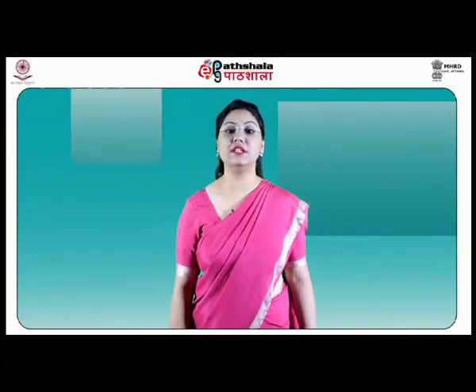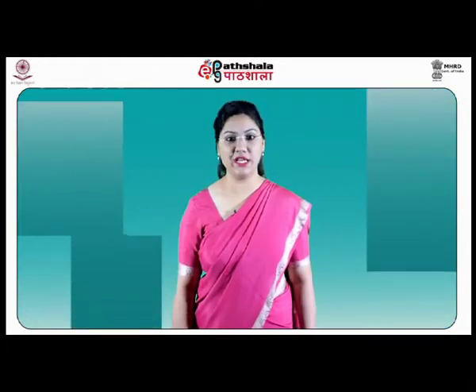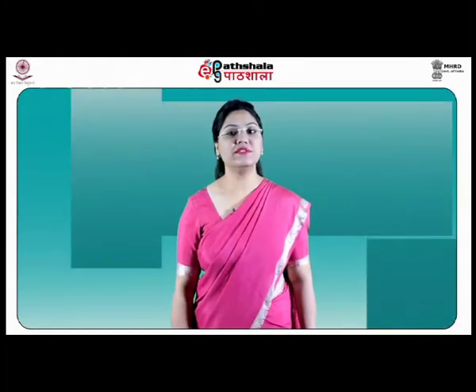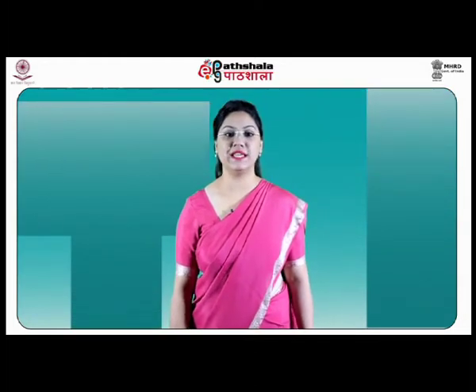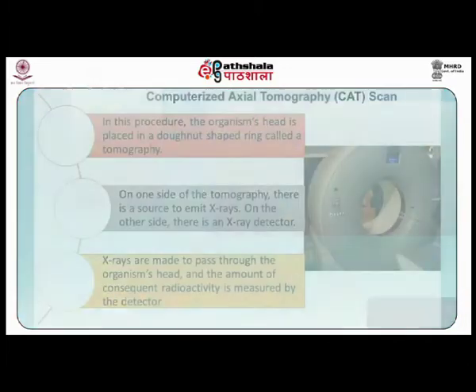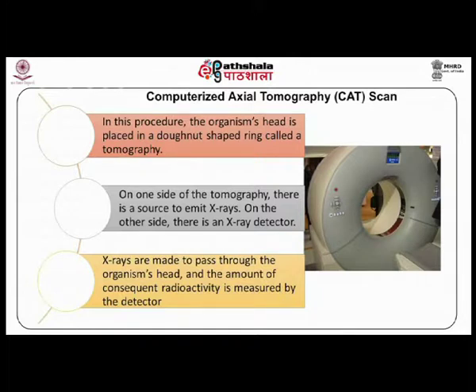Techniques to study the living brain. In order to study the relationship between brain and behavior, it is important to visualize the brain when it is actually engaged in performing certain actions or behaviors. Several techniques have been developed for the purpose. They are computerized axial tomography, CAT scan. In this procedure, the organism's head is placed in a donut-shaped ring called a tomograph. On the other side, there is an X-ray detector. X-rays are made to pass through the organism's head, and the amount of consequent radioactivity is measured by the detector.